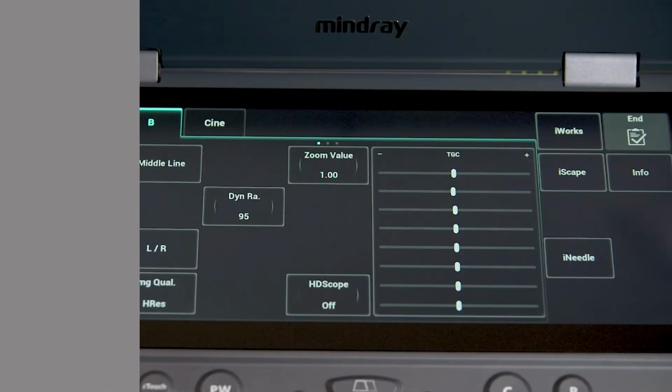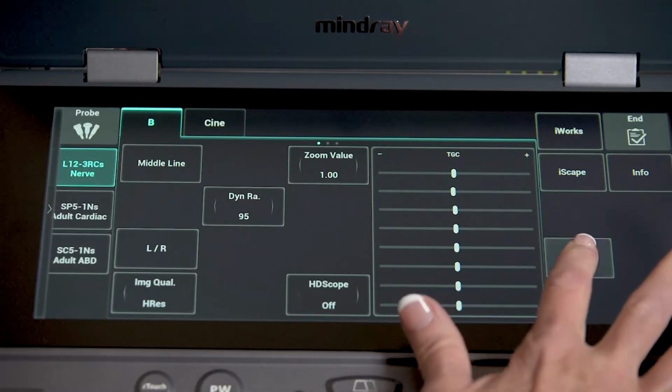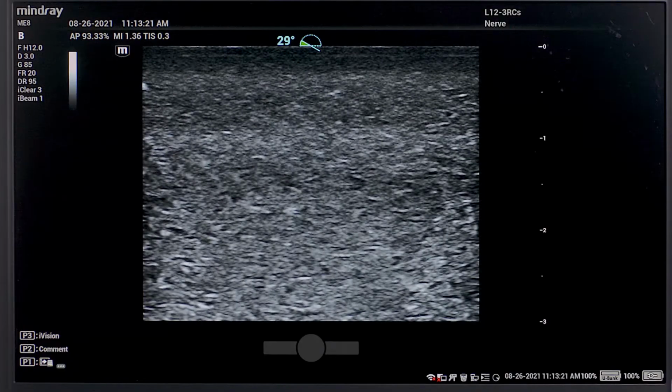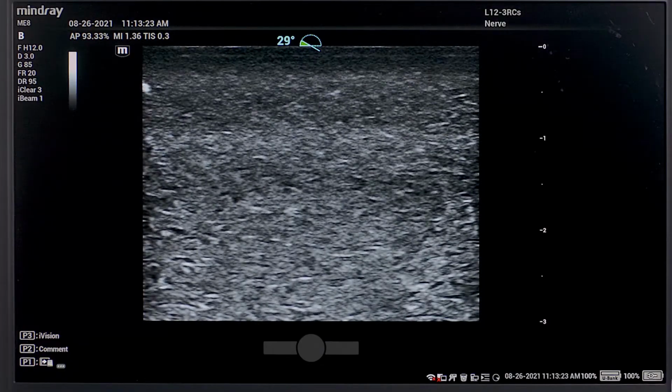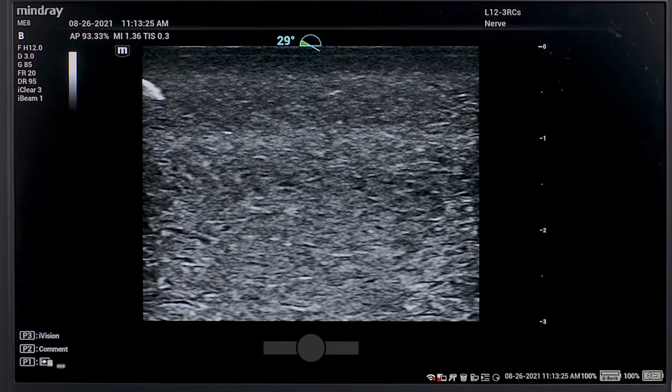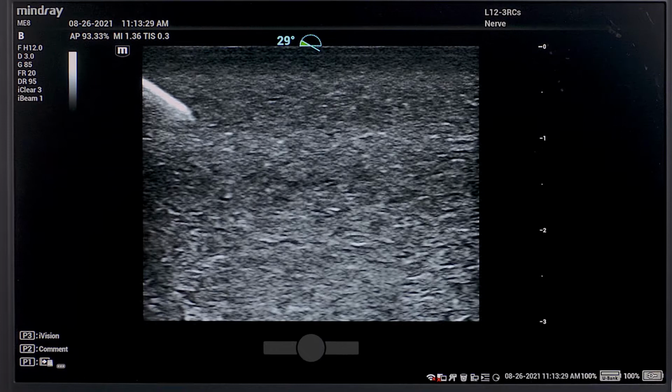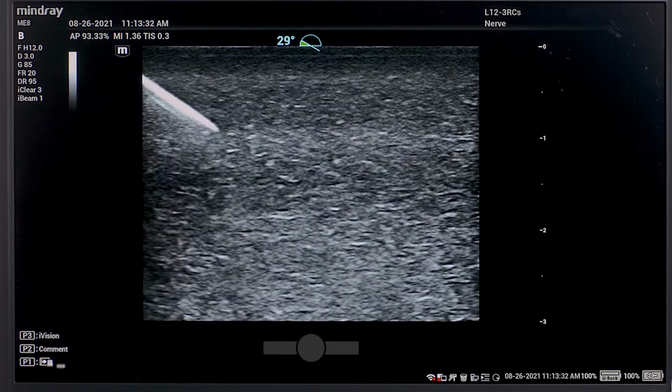The iNeedle function can be assigned to a control panel key or touch panel tab. Choose iNeedle from the assigned location. iNeedle is compatible with all linear and curved transducers. This needle visualization software is based on beam steering and only functions for in-plane procedures.